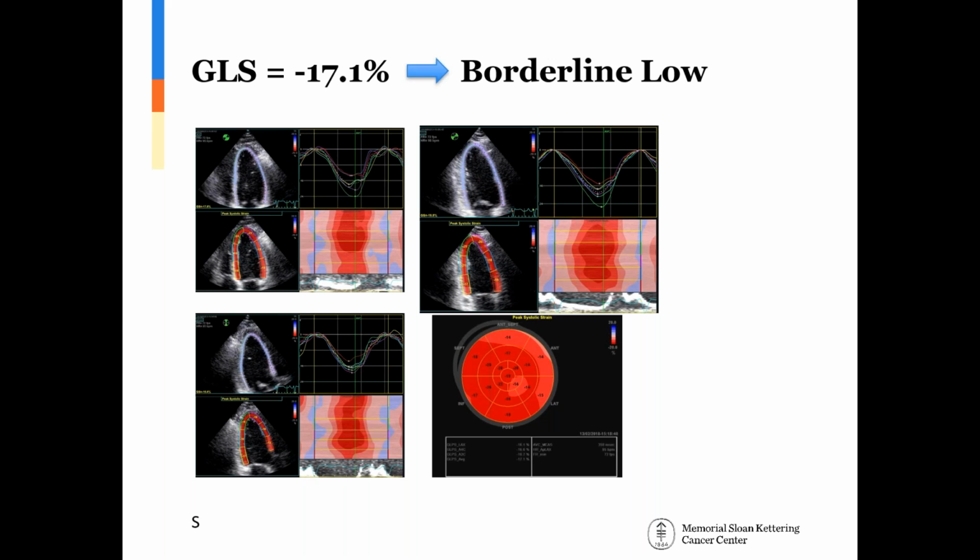And I will have a couple of slides in the end as practical guidance for those who are trying to get strain started in their laboratory. For example, and Teresa and Jeannie can also share their experience, you train, you have a specific protocol. We have the apical views all consecutively.